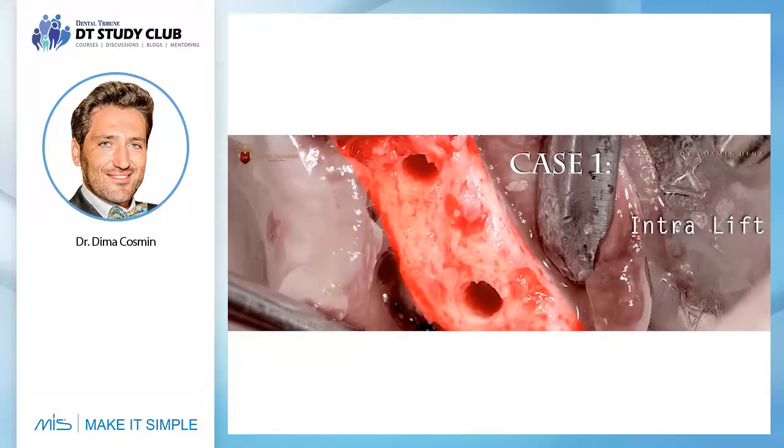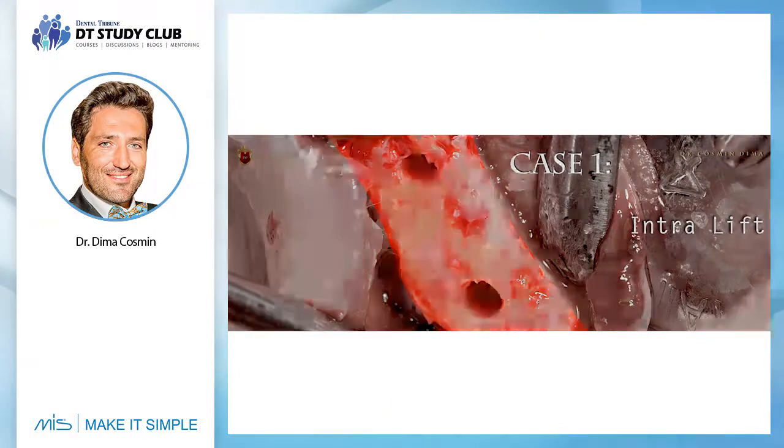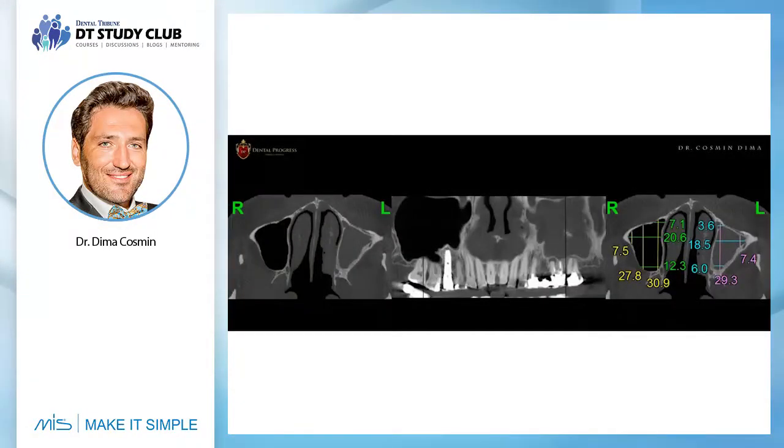So case 1 is about intralift. I will show you at the end, at every case, even a movie, to see more details, and I will try to detail every step to have a global image at the end to do it without any risk. So, this is a case which certainly must be decided before starting talking with our ENT surgeon too.